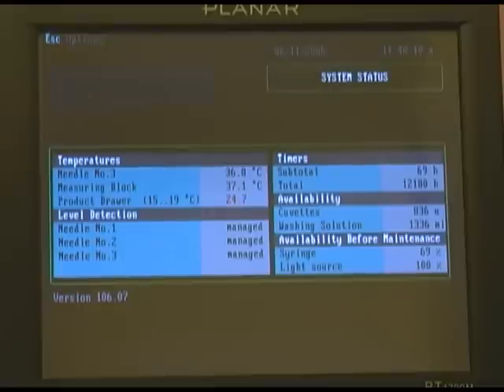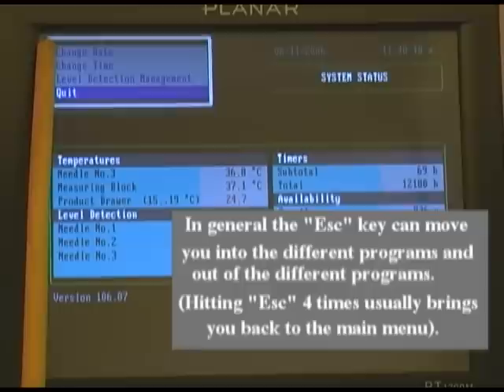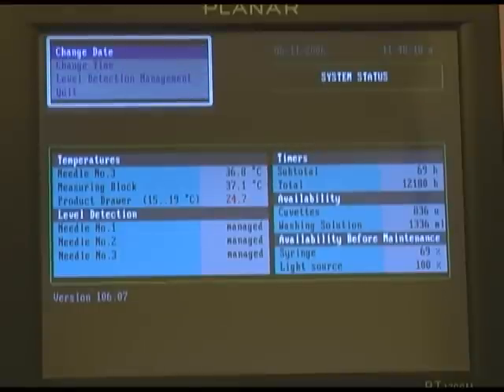By pressing the Escape function, you bring down a drop-down menu of the date, time, and level management applications to change the particular date and time to reflect a date change, for instance, a different time zone and/or leap year.